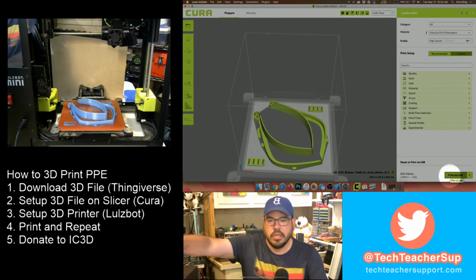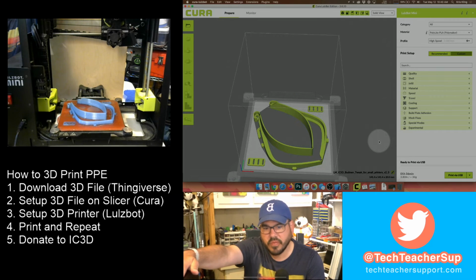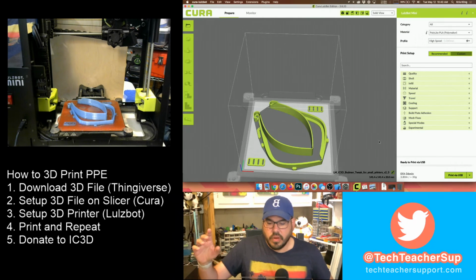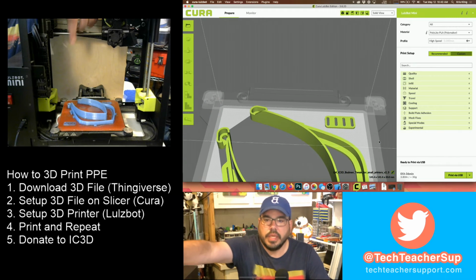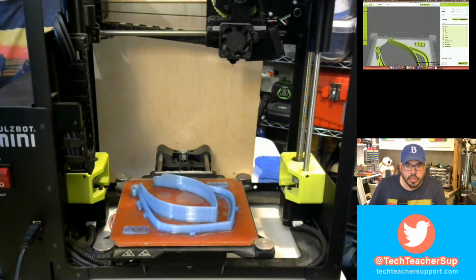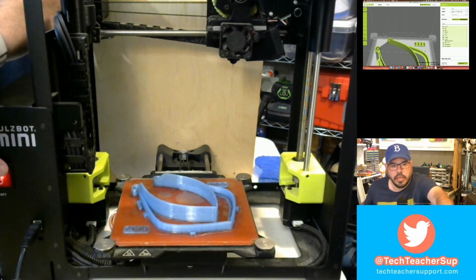So now we're on to step 3B, which is to set up our 3D printer. So we got the software set up. Now we need the hardware set up. So two things. Number one is, first of all, we obviously need to remove the piece that's already printed. So we're going to remove that and then we'll print the new one. All right. And let's see if I can't get a better picture of our 3D printer here. Okay. So step one is we're going to turn this on, and here is our on button.